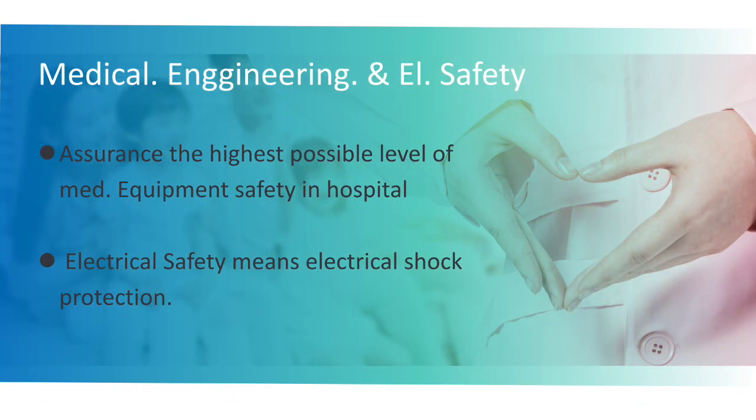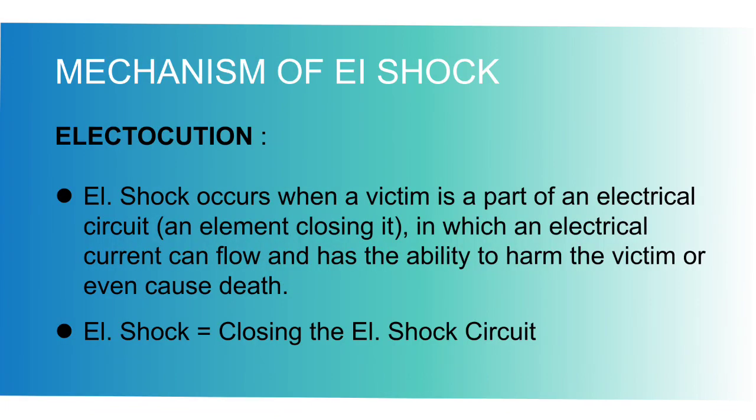Medical engineering and electrical safety. It ensures the highest possible level of medical equipment safety in hospital. It deals with the concept of medicine and biology for healthcare purpose. Electrical safety also refers to the electrical shock protection. So what is the mechanism behind this electrical shock?